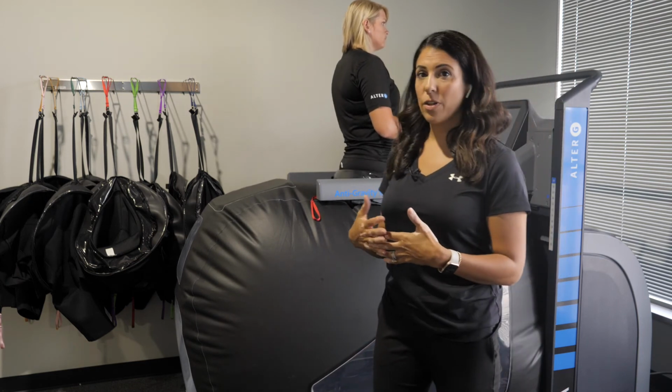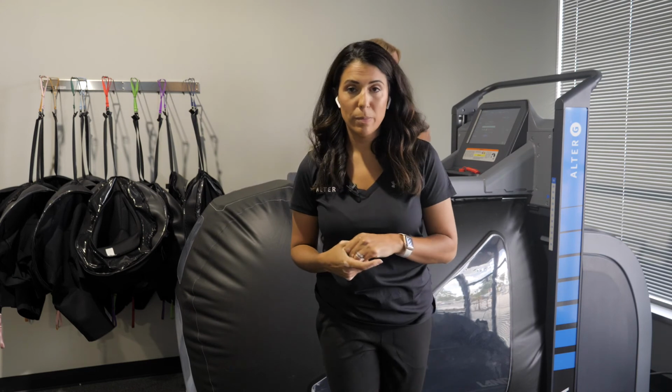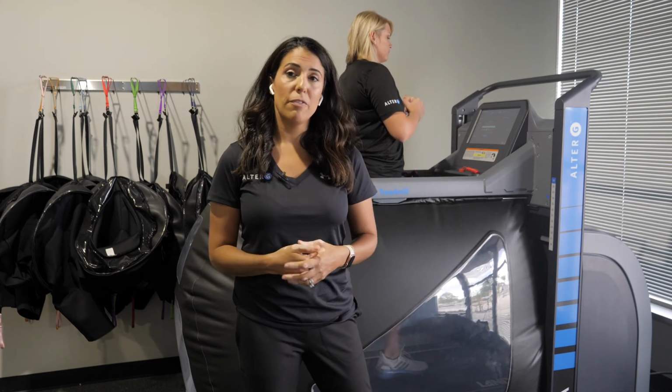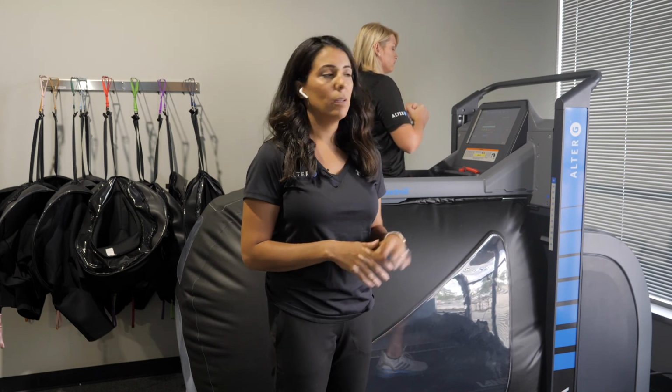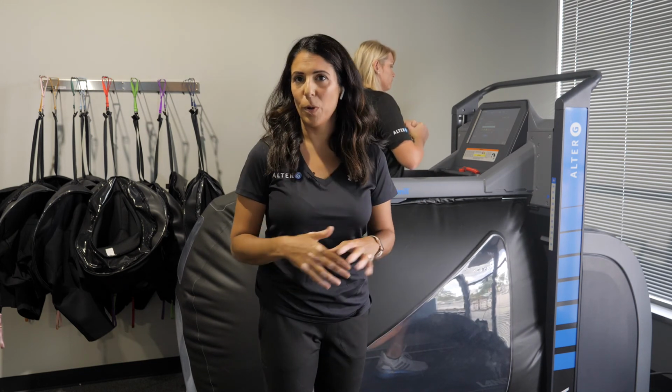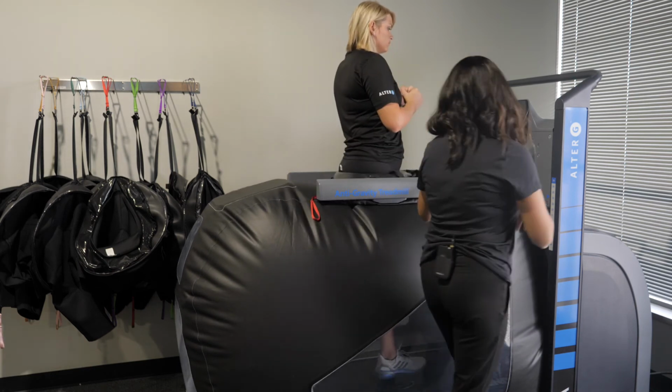Again, utilize the StrideSmart feature to give you some input while these exercises are being performed. But even if you don't have the software, you can always do these exercises again. Just don't turn on the treadmill belt, or you press pause in the middle of a workout and use the fall-safe environment, the body weight support, to do so. All right.